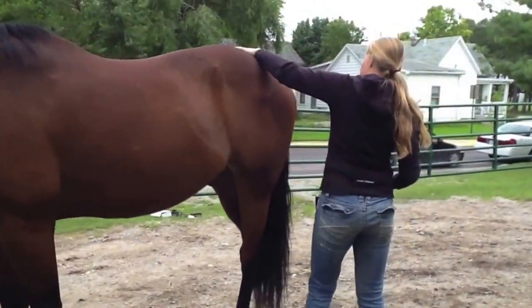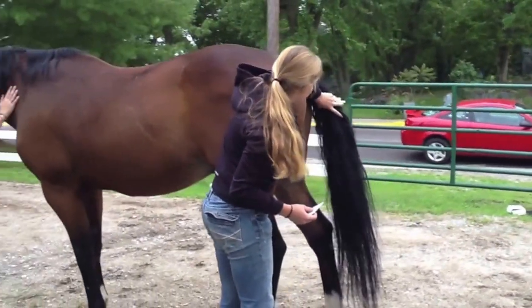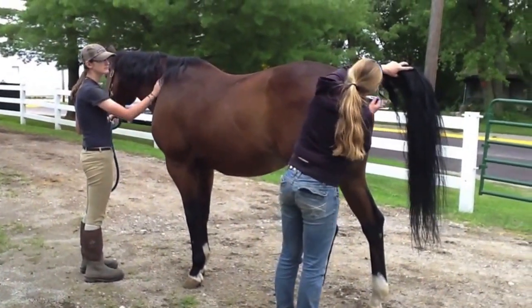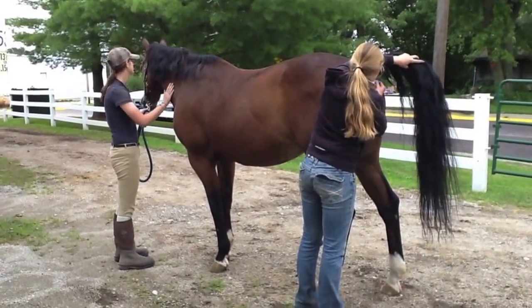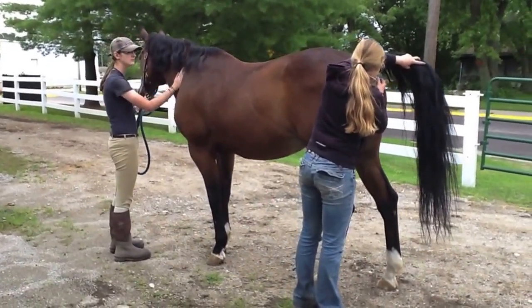Okay, so to do this, you want to put your hand below the horse's tail, grab it, pull it up gently, and then stick the thermometer into the horse's rectum. Then turn it on. Then you just wait for it to beep.